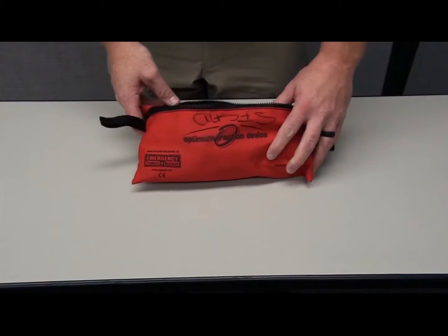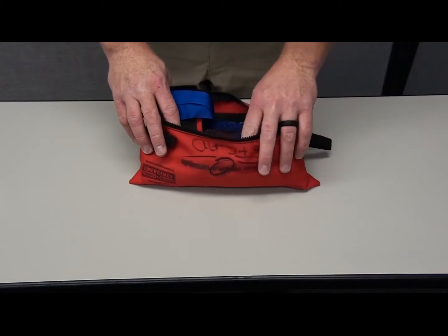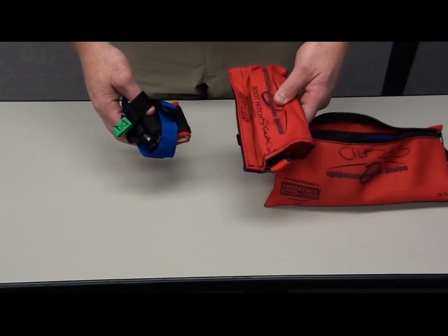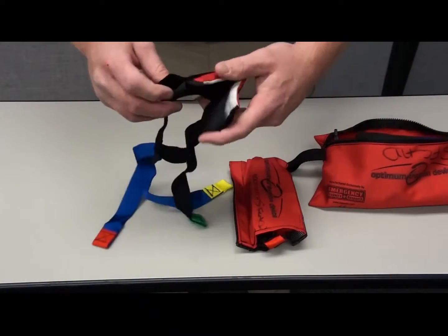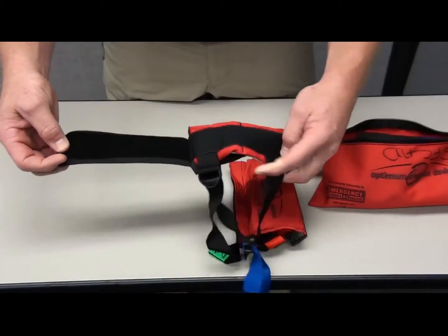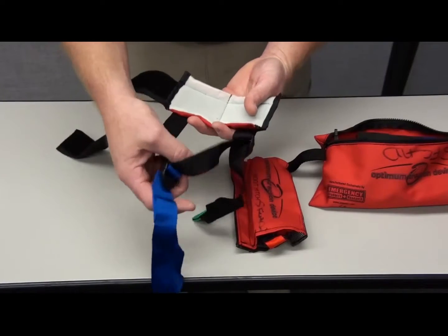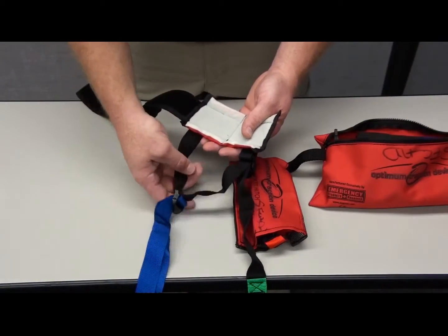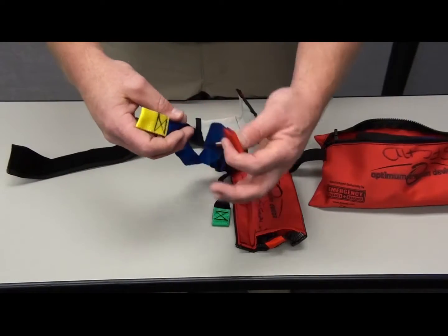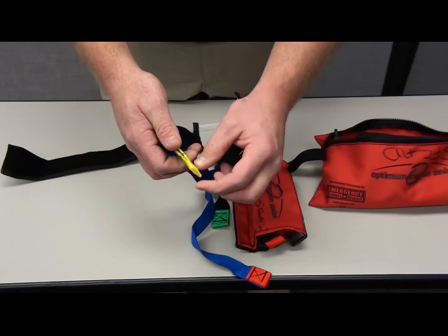When you open the traction splint, there will be several components within the device itself. Two of them are the ankle hitches. This is the basic ankle hitch that we use. Again, very simple. This goes on the back side of the foot. This goes around the bottom of the foot, and we use this to adjust the length there, how to tighten it. This adjusts the length and the tightening of the actual traction.